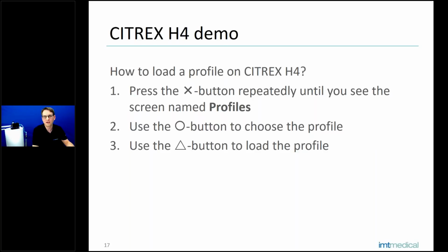So you see, it works a bit differently. The concept is exactly the same. You need the tool here, which is saved on each and every SD card of your CITREX H4 device.